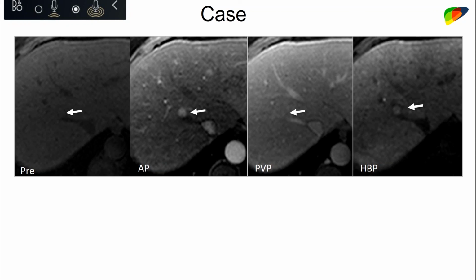If he were looking at that second lesion, he'd want to go through all the images to convince himself whether there is washout appearance and hepatobiliary phase hypointensity. But let's say he became convinced it's a LI-RADS 4. In the year 2020, that does not change the categorization of the first lesion. So both lesions are LI-RADS 4.